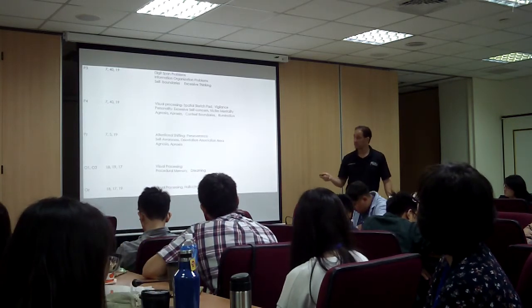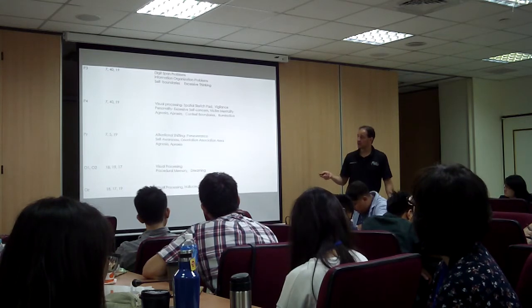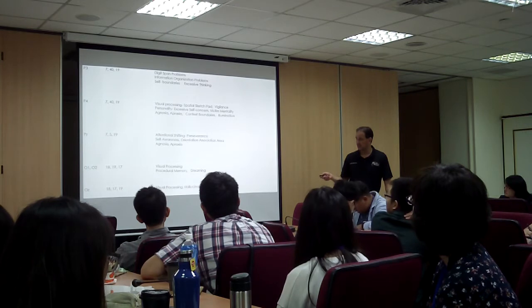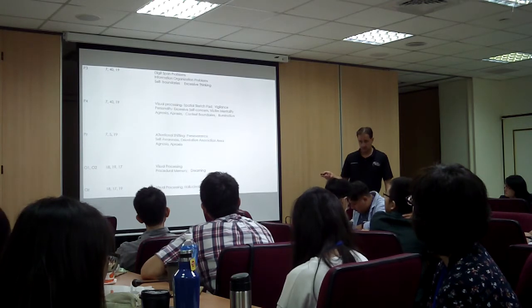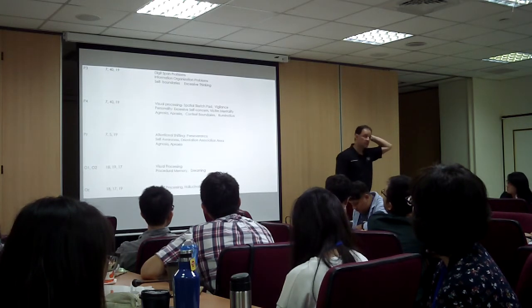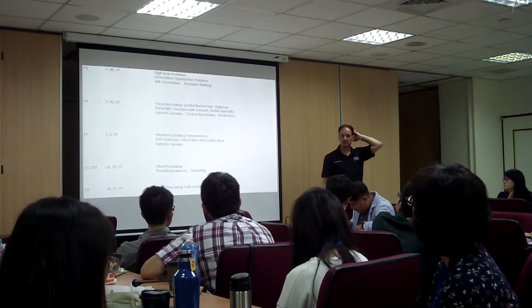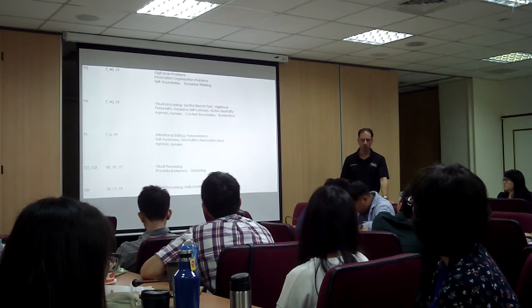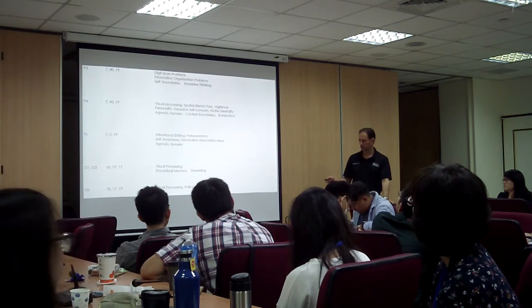Okay, so if you have a client with a lot of high beta or fast brainwave activity at PZ, you put the sensor there. You don't train anything that's fast. It helps them calm down. It's a very nice relaxing protocol.